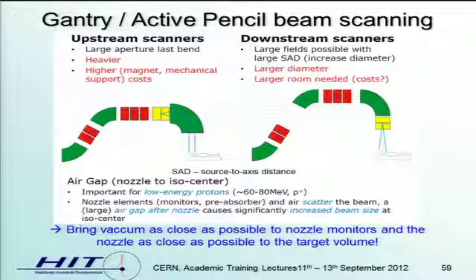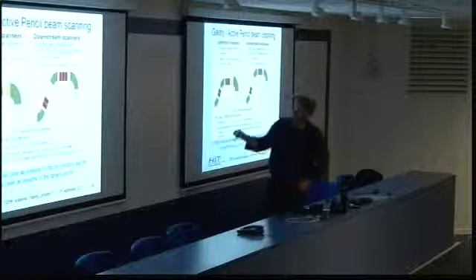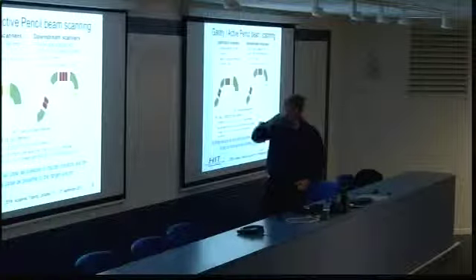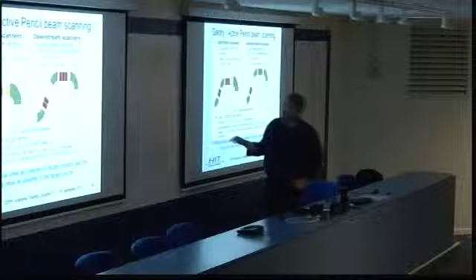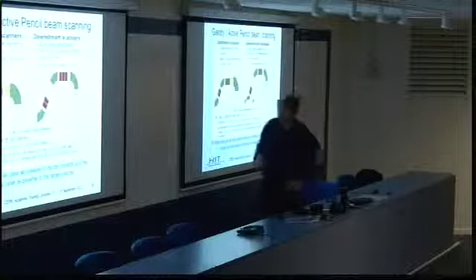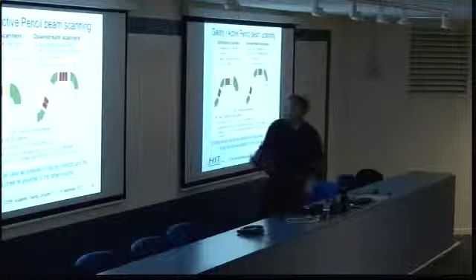This is the most common implementation you find for proton gantries, to place the scanner magnets just after the last bending dipole, because it's possible with the 2.2 Tesla meter maximum rigidity of the beam to bring out the beam to an area of 20 by 20 centimeters.